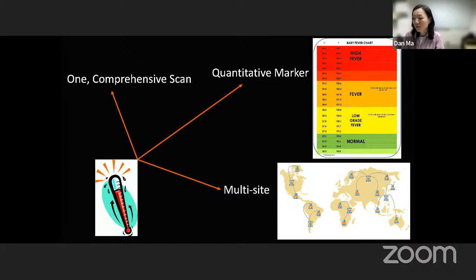It's not just intensity, because from the tissue side you can get some microstructure features. Then from the image side, we're trying to match those features using special design. So this is one on the feature correlation. Of course, there are lots of other challenges, including the tissue image alignments and other things.